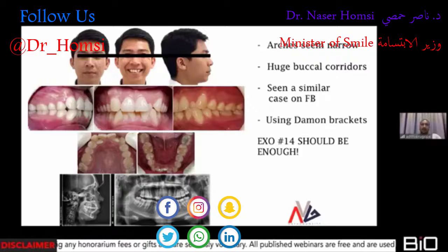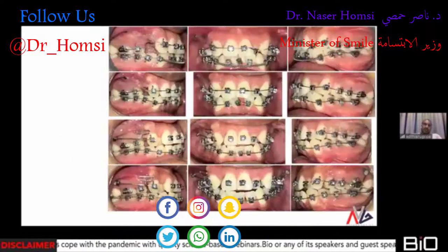And we as orthodontists, we as learners, were very influenced by such words, and we were under the impression that we could replicate the same. So this is what we're talking about, reproducibility. So I decided to use a very thin wire and placed an implant over here, started to retract the canines just to tip them back a little bit so that I could get some space over here.